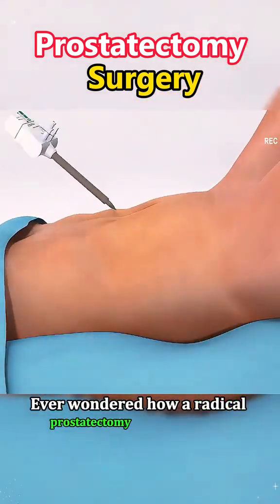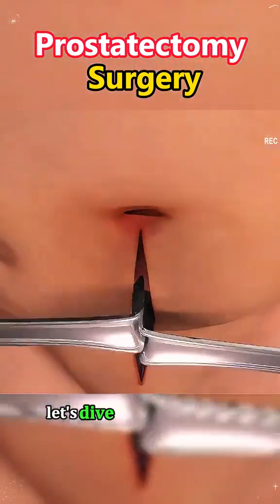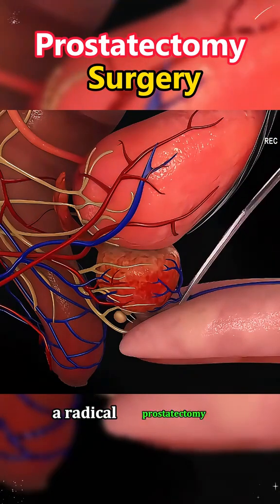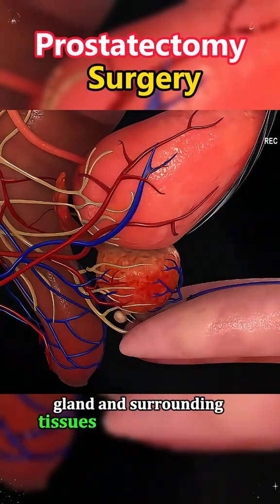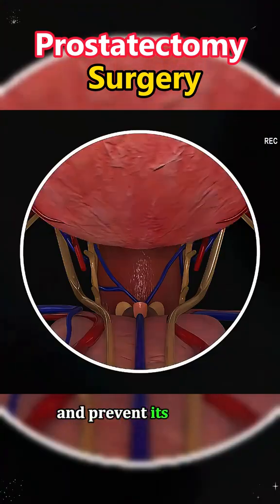Ever wondered how a radical prostatectomy is performed? Let's dive into the process. A radical prostatectomy involves the removal of the prostate gland and surrounding tissues to eliminate cancer and prevent its spread.